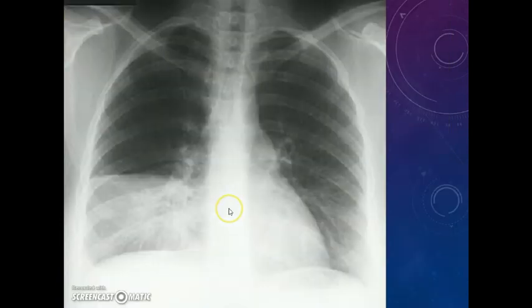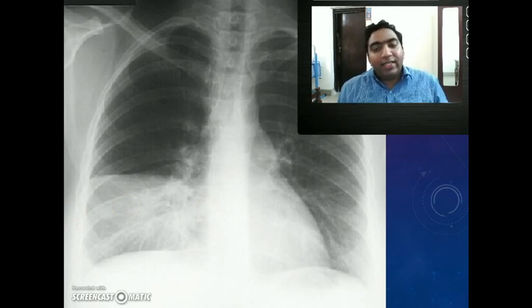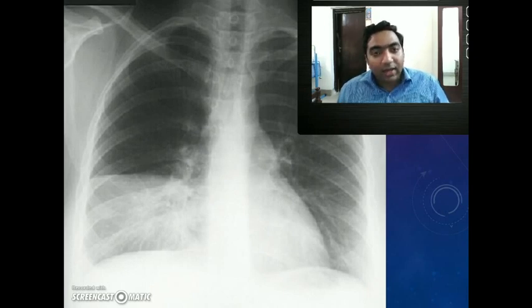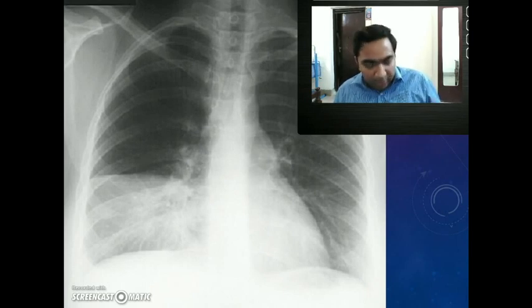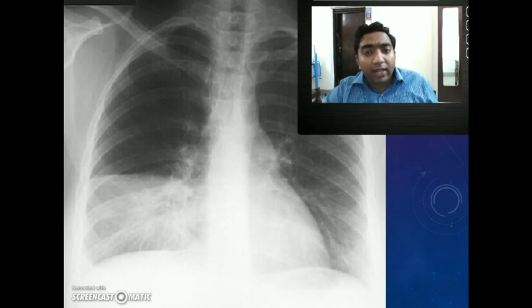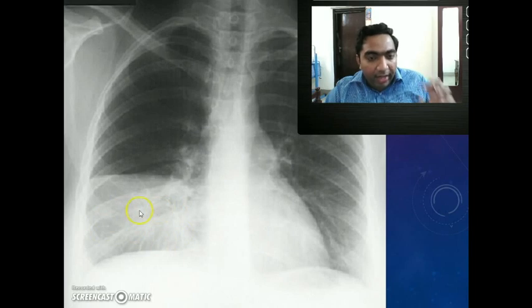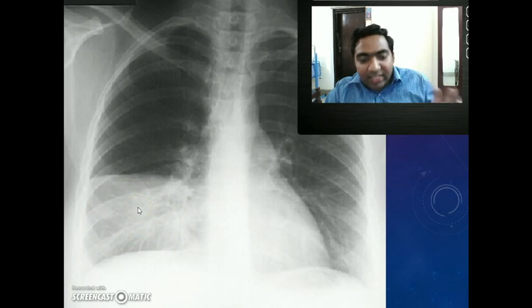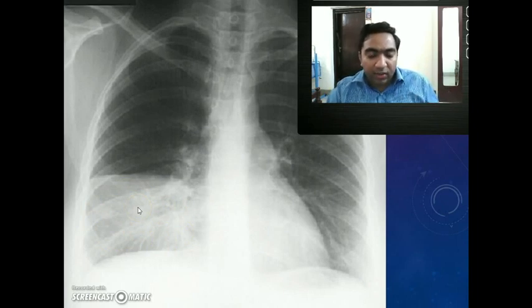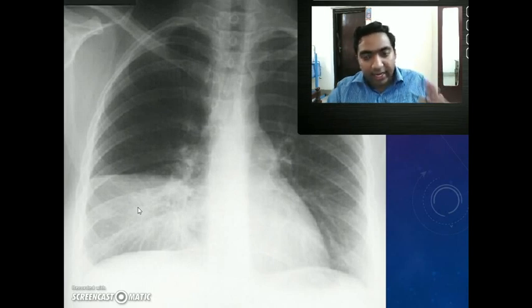We can also see the intercostal drainage which is the treatment of the same. Now, this is another X-ray commonly seen in clinical practice — this is a case of consolidation. Postoperatively in many patients, we come across consolidation or pneumonia. When we see consolidation, it is also called pneumonia. How will we know whether it is consolidation or pneumonia? We will see some air in between — that is called air bronchogram. When we see air bronchogram in the white shadow, we can make sure it is a consolidation suggestive of pneumonia. Air bronchogram in an X-ray is most commonly suggestive of pneumonia.